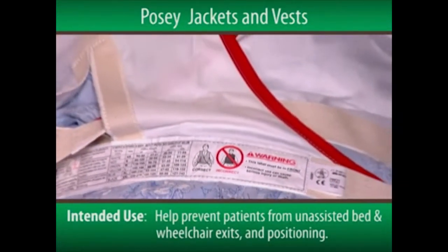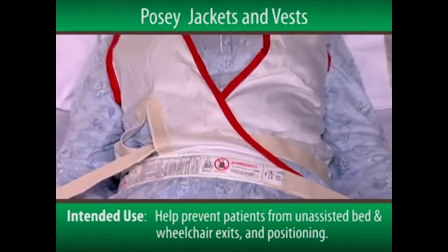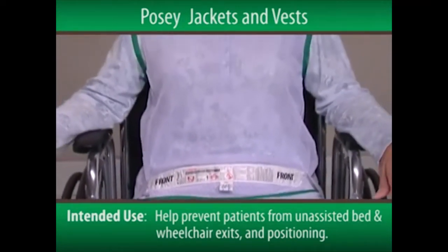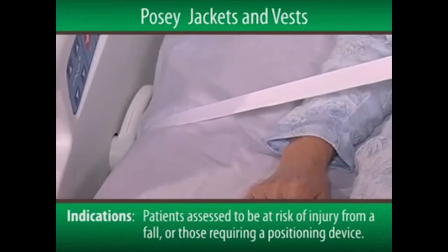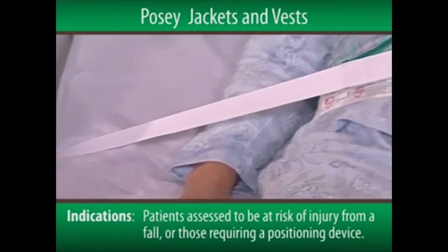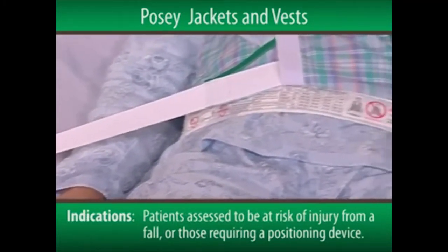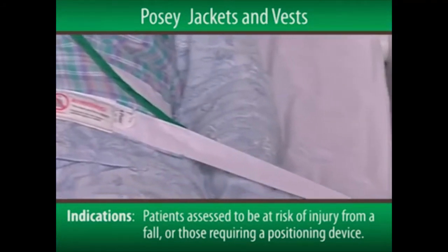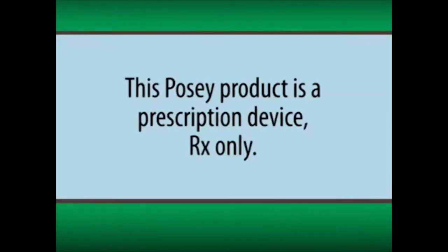The POSI jackets and vests are used to help prevent patients from unassisted bed and wheelchair exits and positioning. They're indicated for patients assessed to be at risk of injury from a fall, or those requiring a positioning device to assist medical treatment. It's important to note that this POSI product is a prescription device, RX only.